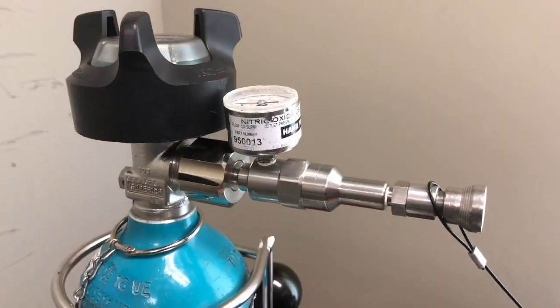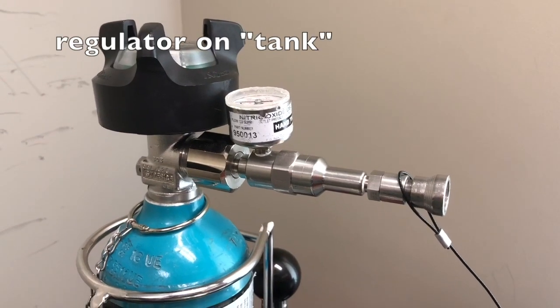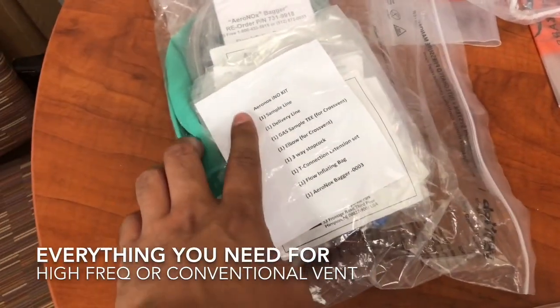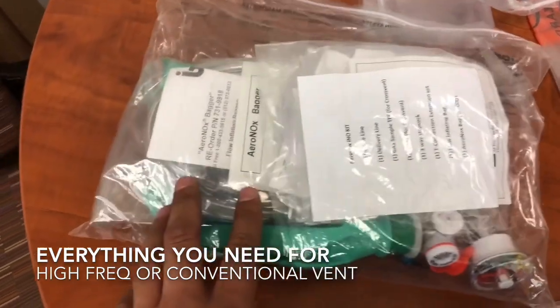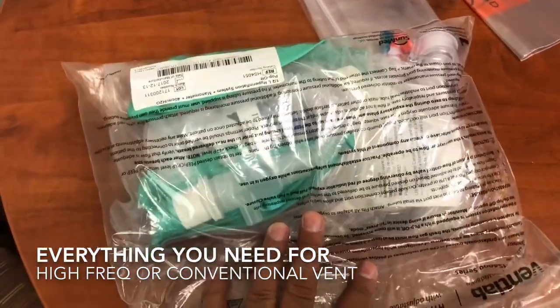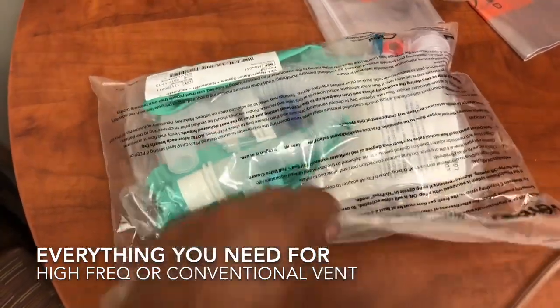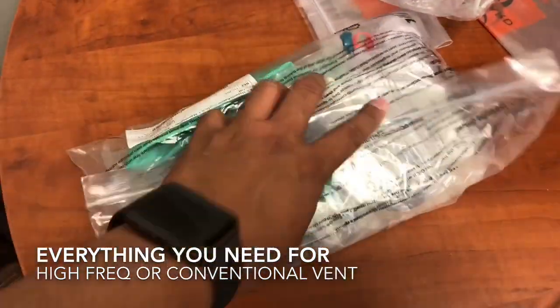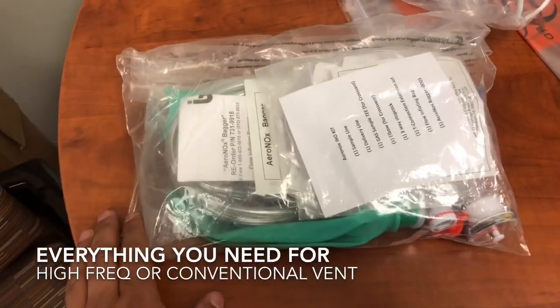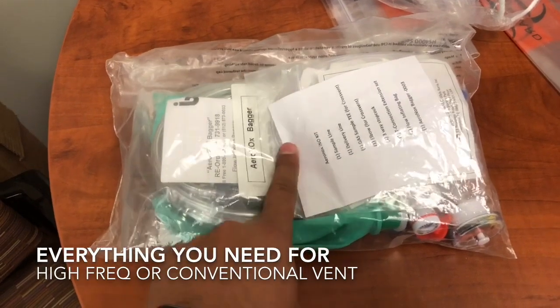This is our nitric delivery regulator that will always be on our regulator. This is what the kit looks like — it has a list of all the stuff that's in there. So if you need to have a patient on nitric, you just grab this bag. Whether it's high-frequency or conventional, everything you'll need will be in this bag.